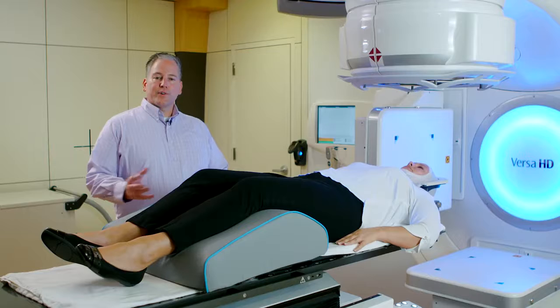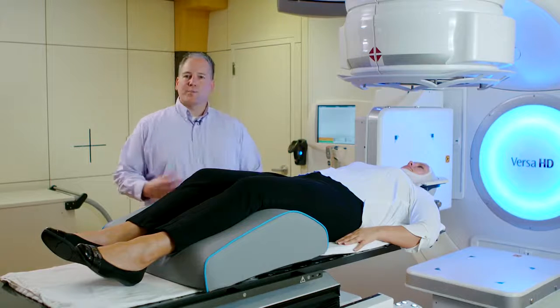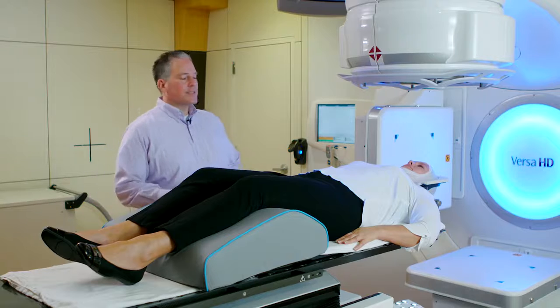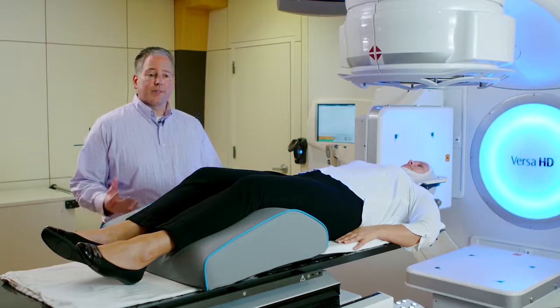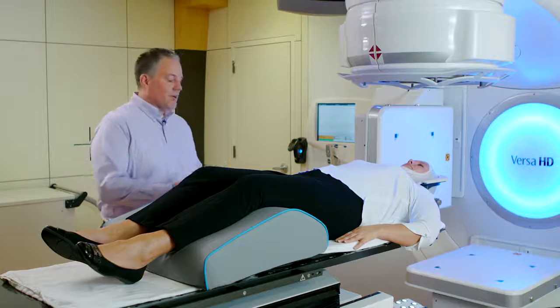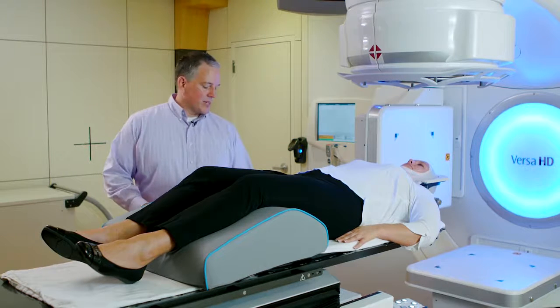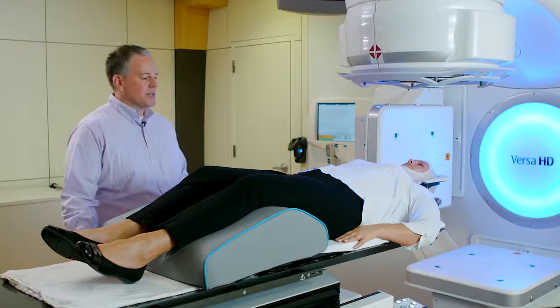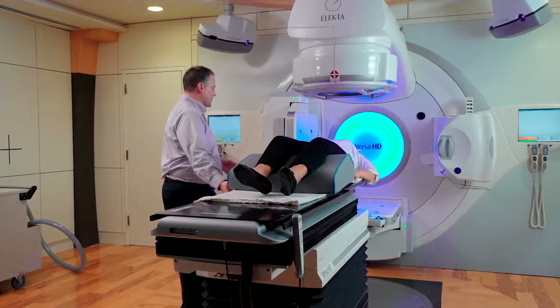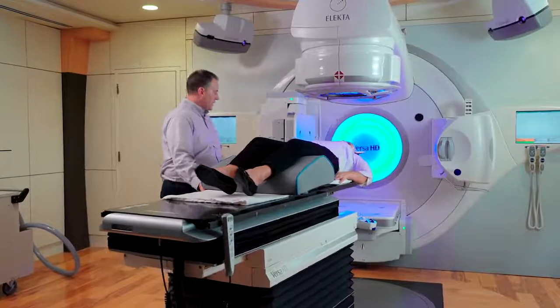Now that we've delivered our first beam, our second beam is actually going to be non-coplanar. So we're going to have a couch kick on that beam. The Catalyst system is directly synchronized with your delivery system. So when you pull up a field with a couch kick, we're going to know that exact couch kick, and we're going to let you know when the patient's properly positioned. You can auto drive the couch. For this particular patient, I will just pull the patient into position, say a 30-degree couch kick.